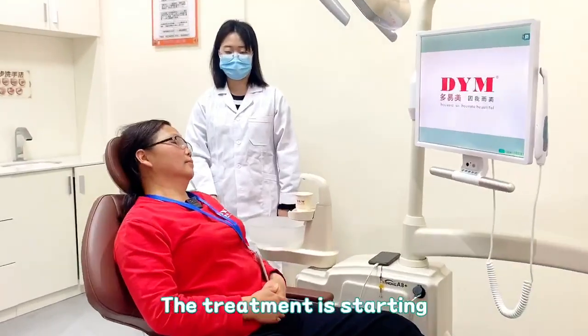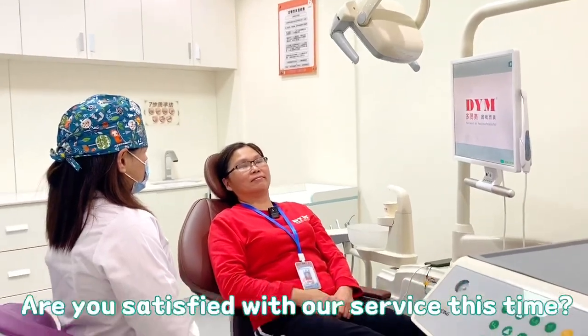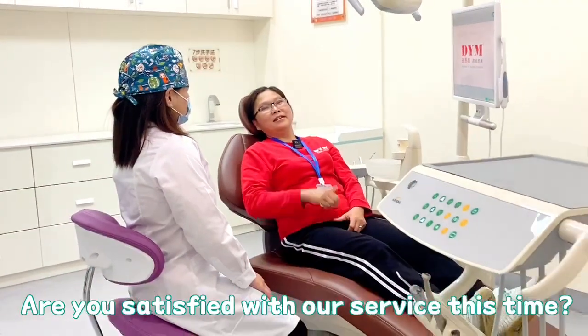The treatment is starting. The treatment is completed. Are you satisfied with our service this time? Very good.